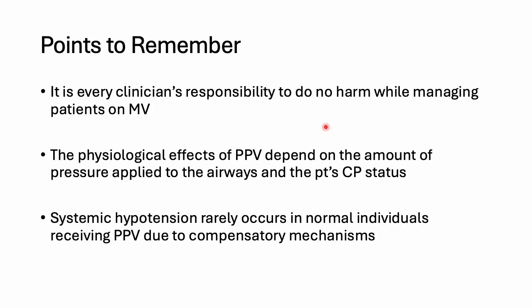So last slide, summarizing everything about what you need to know about mechanical ventilation. It's your responsibility to do no harm when you are managing patients or clients on mechanical ventilation. So you need to know the effects of positive pressure ventilation on your patient, and how your management in terms of physiotherapy interacts with the patient receiving mechanical ventilation. Therefore, you need to know the modes and the types of breaths that the patient is receiving in order to determine what you can do with the patient.